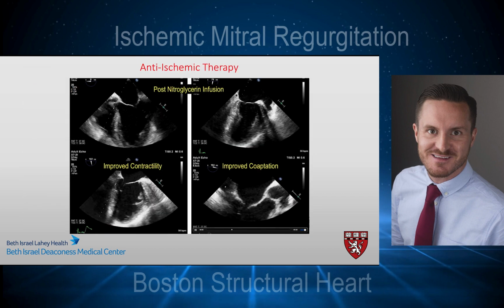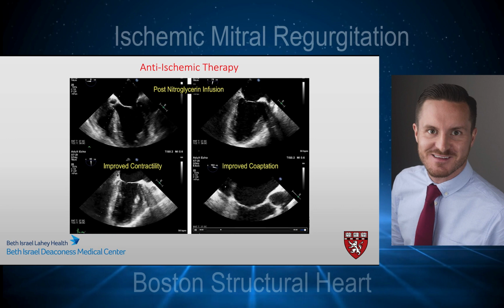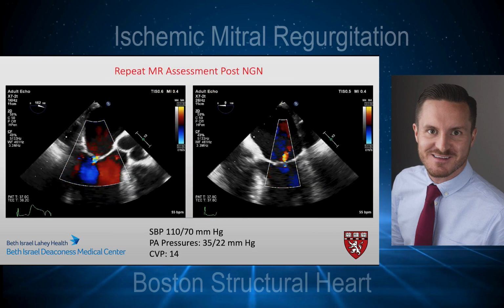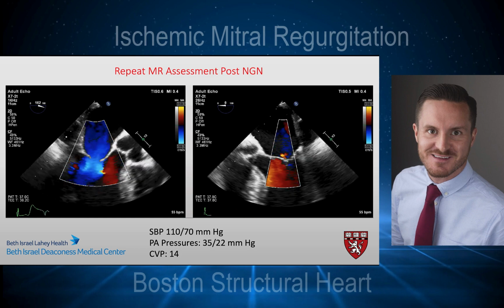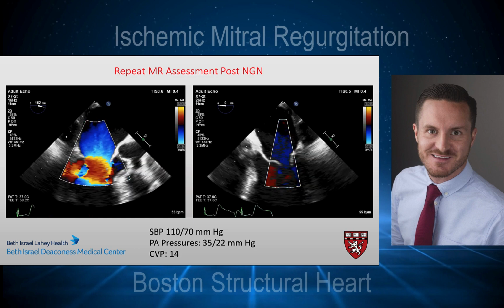Also, after we started the anti-ischemic therapy, we saw an immediate improvement in LV contractility and also improved coaptation of the mitral valve leaflets. We again re-examined the mitral regurgitation after initiation of the nitroglycerin, and the regurgitation had come back down to mild in nature.